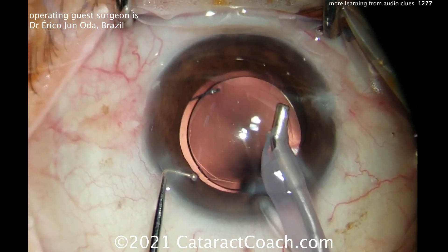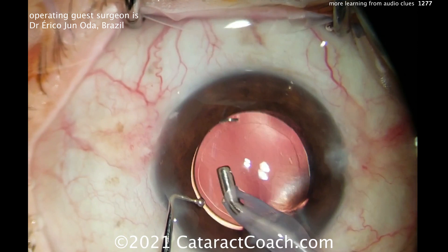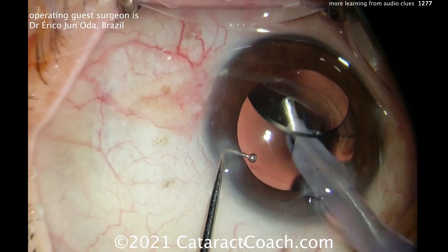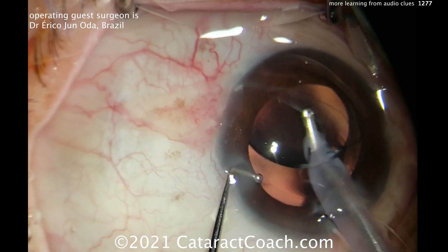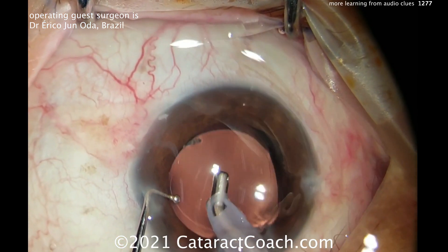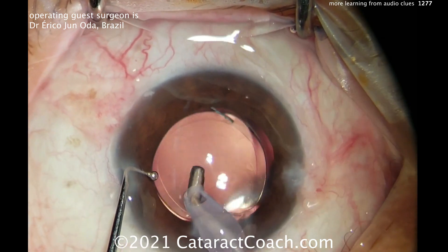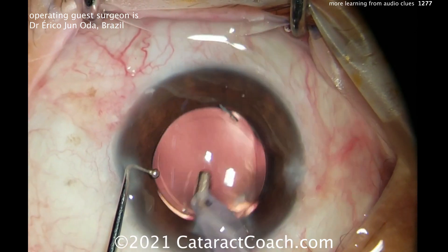The last thing I'll leave you with is the rules. There are actual laws regarding audio recording, different than video recording. You go to places that have video cameras for security but they don't necessarily have audio. So look up the rules in your particular place to make sure you're allowed to audio record patients and staff. But I think there's a lot to be learned from this, and you can see from this video that using audio clues can help make you a better cataract surgeon.